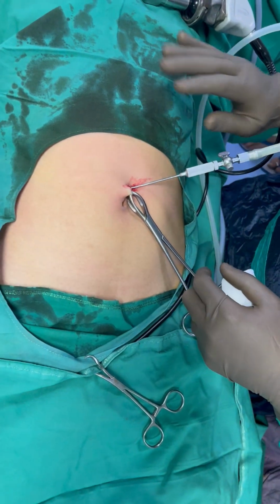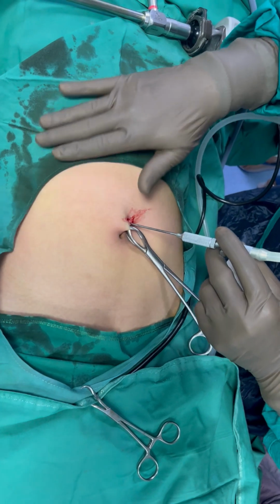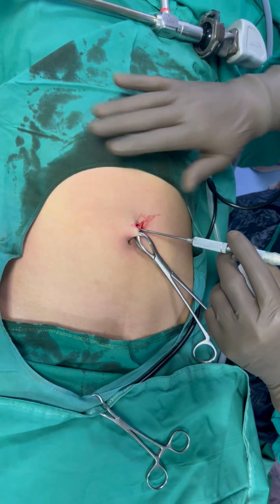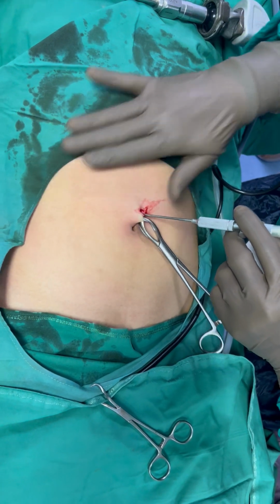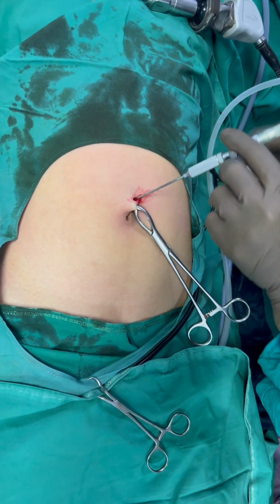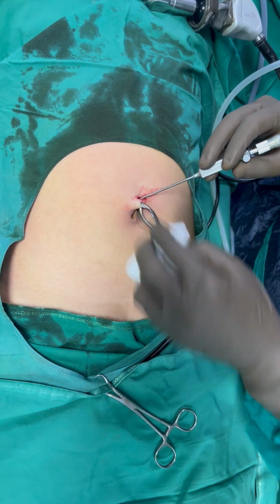See, we can hear the loss of dullness over the abdominal cavity. You can hear a resonant sound because air is filled into the peritoneal cavity.